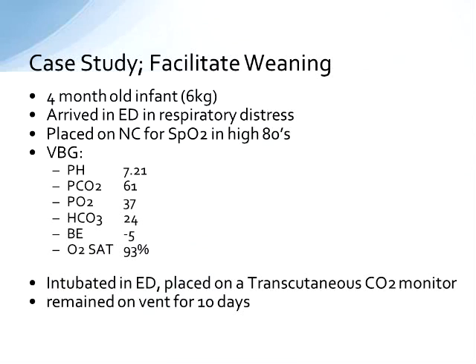So after 10 days, they did go ahead and attempt extubation in this patient. Felt like they were as low as they were going to get without just straight extubating the child, and ended up extubating to non-invasive ventilation.